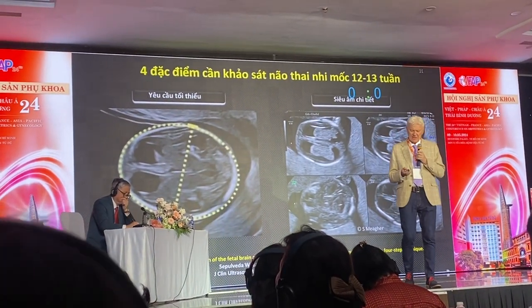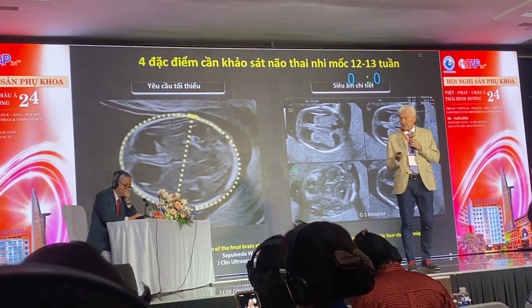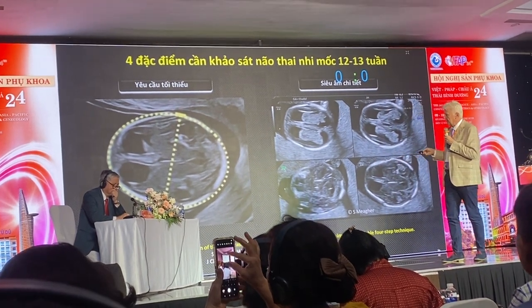When we start the examination, we do a BPD. On the left-hand side is the minimum, doing a BPD and taking a head circumference.